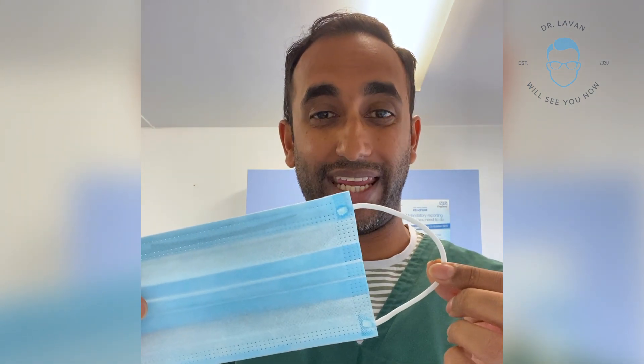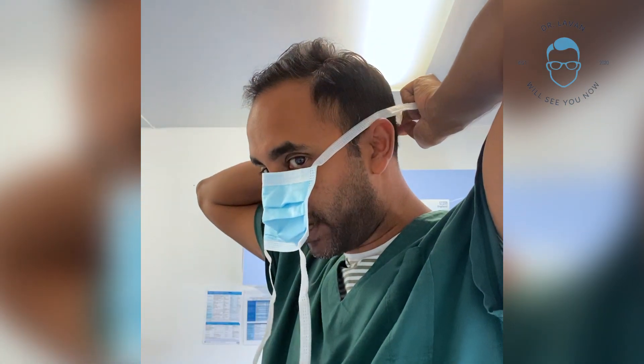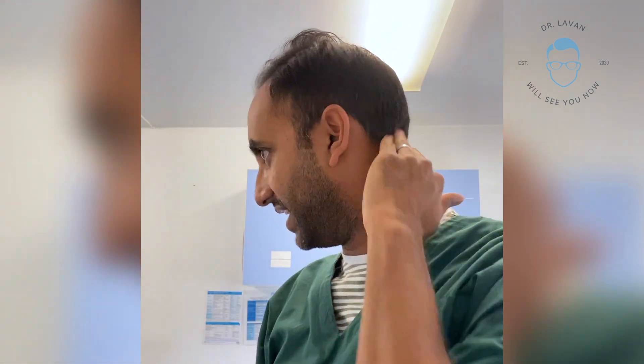The two masks we currently have available for the public are this one which is called the ear loop and this one which is the drawstring. With the strings this is a lot more easy — it's got a nice soft area to place on the bridge of the nose to form a nice tight seal. One string must go up to the crown at the back of the head and the bottom string at the nape of the neck.